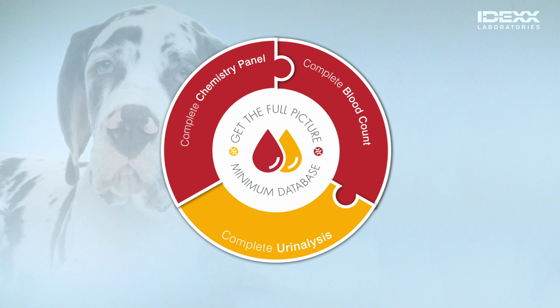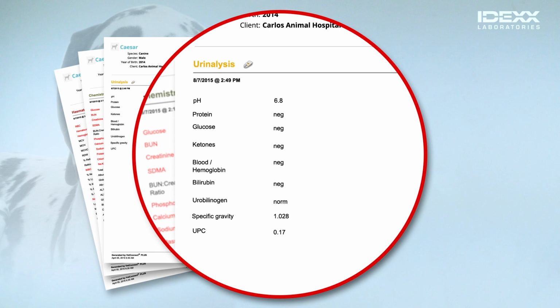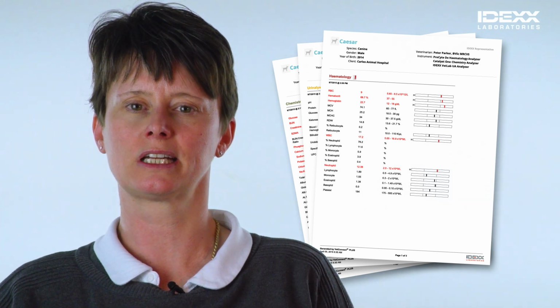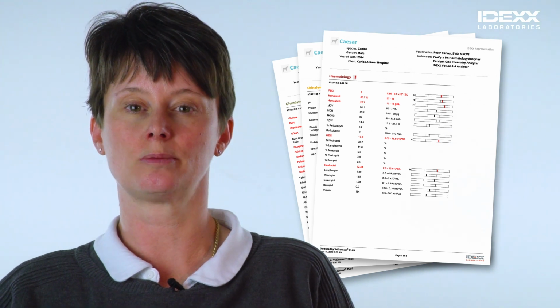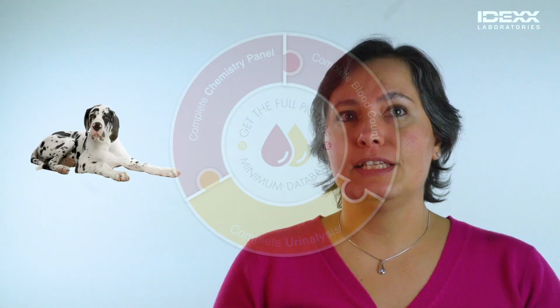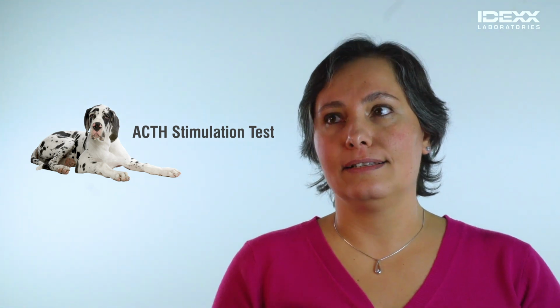When we look at the urinalysis, which we didn't have when we just did the Chem10 and the PCV, we can see that now, when we try to interpret our urea, creatinine and SDMA, and we look at our urine-specific gravity of 1028, that this is not appropriately concentrated for the dog, and it again flags the consideration over the kidneys, but also over Addison's, because when we have a low sodium, the dog is unable to concentrate its urine adequately. So overall, this patient is highly suspicious of having Addison's disease, and we should test for that. And we should consider performing an ACTH stimulation test and starting therapy directed at treating Addison's.